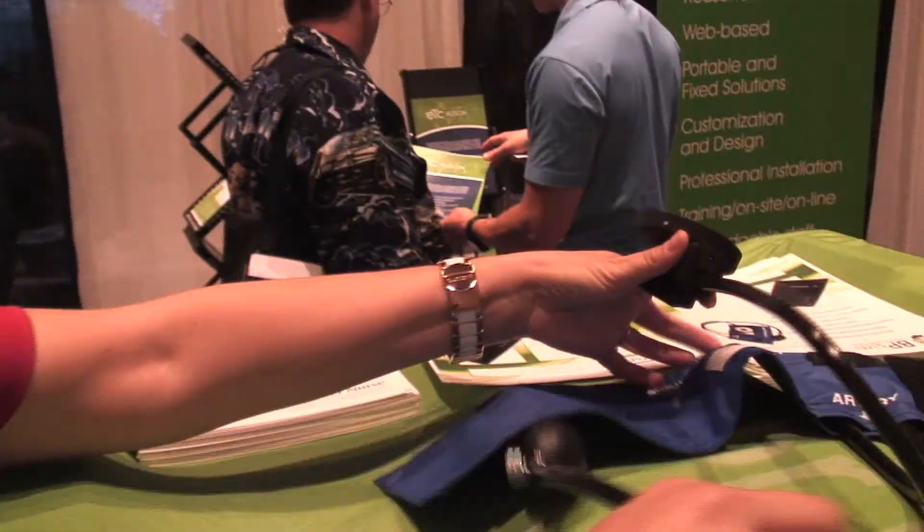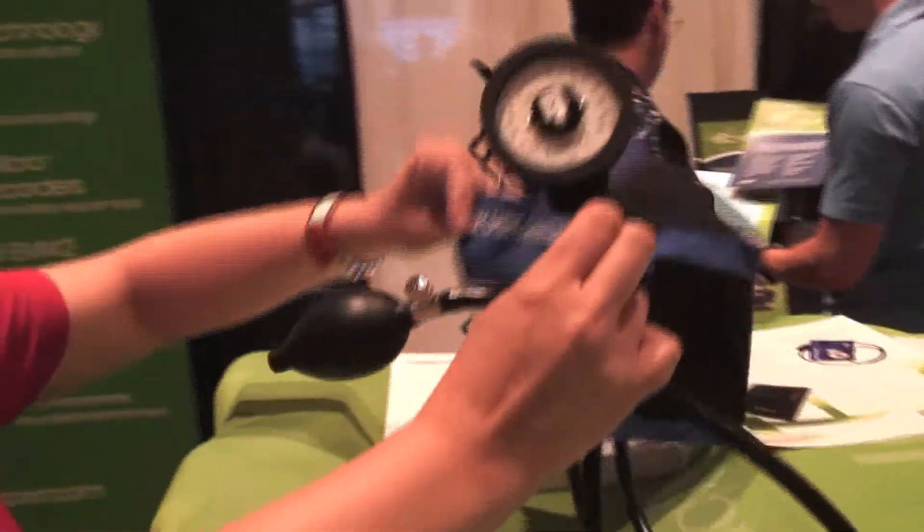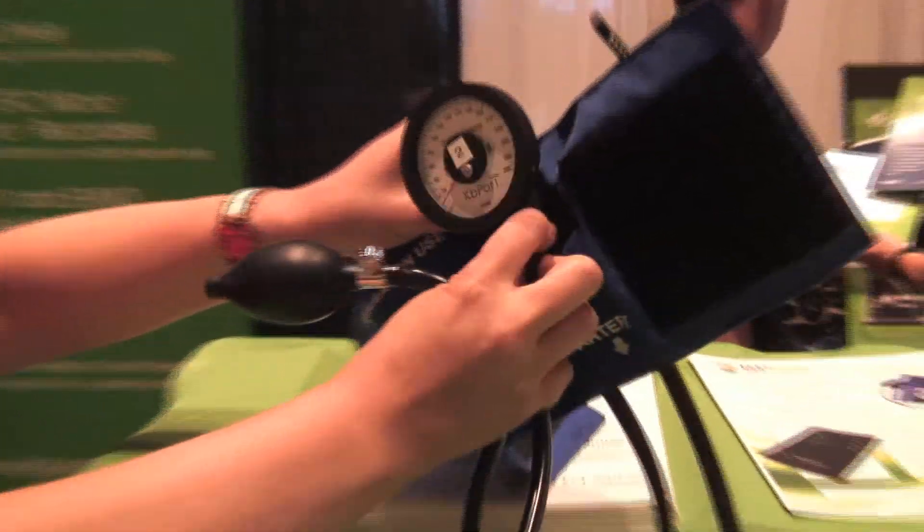You use this blood pressure cuff right here. It has the sphygmomanometer on it. It'll go around any arm.